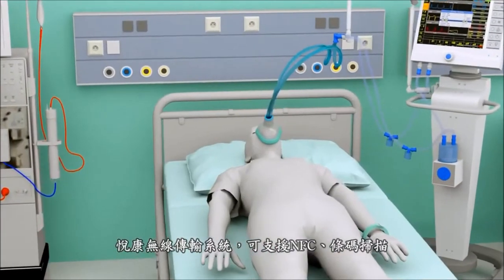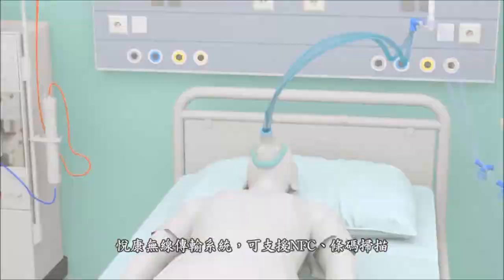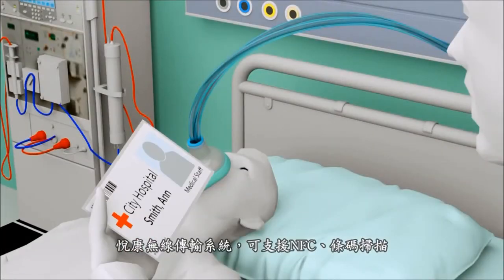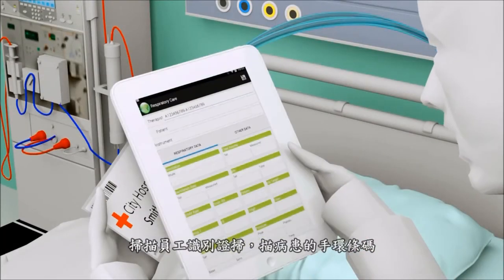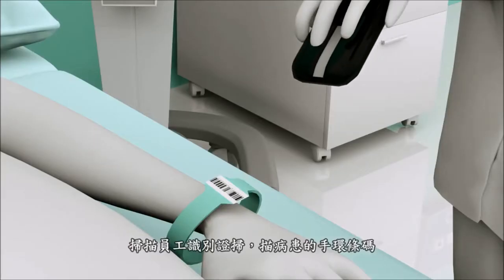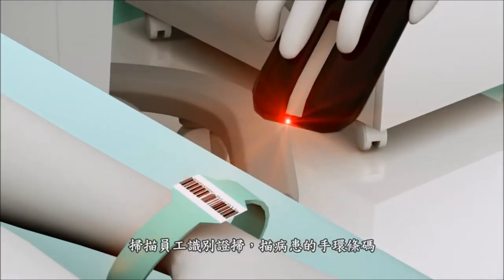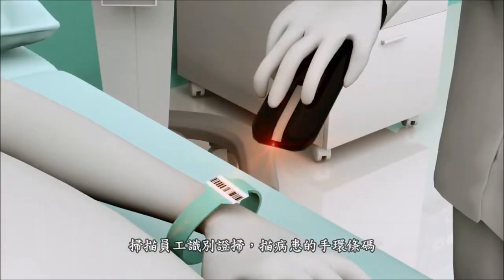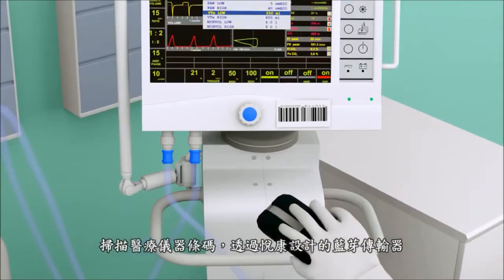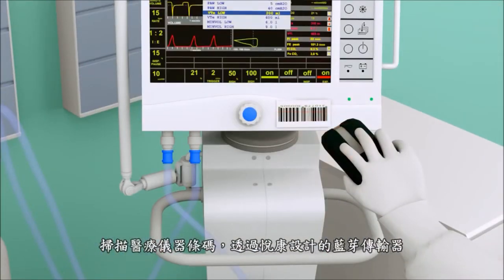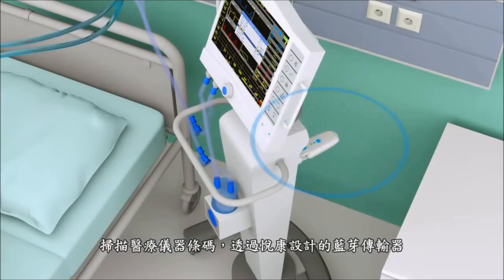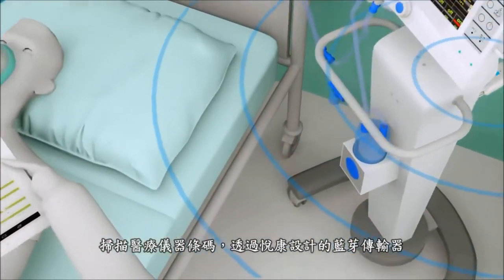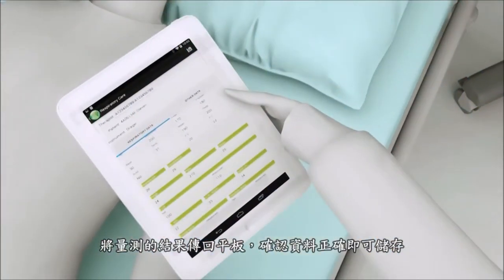Uekong YDOS solution utilizes NFC and barcode scanning method from staff, from patients, and from medical devices. Data is transferred back to mobile device via Uekong Bluetooth dongle.